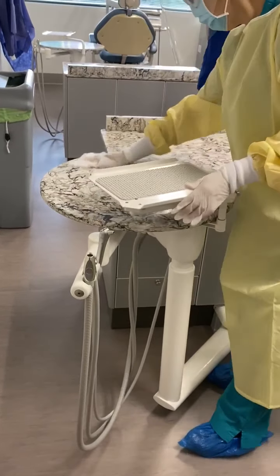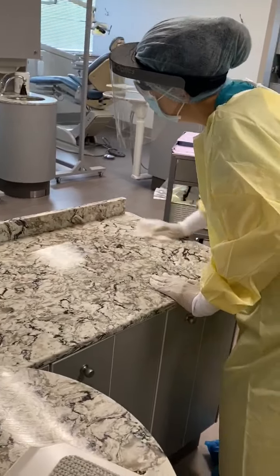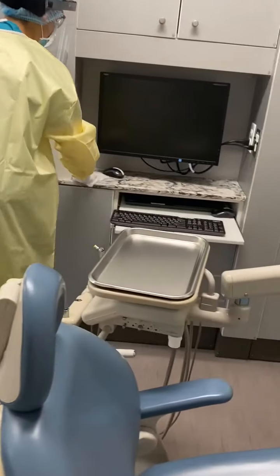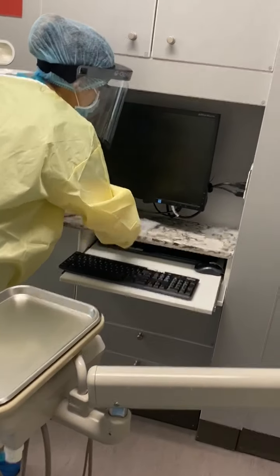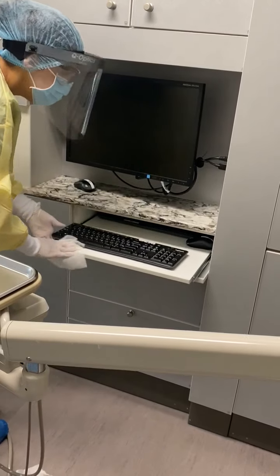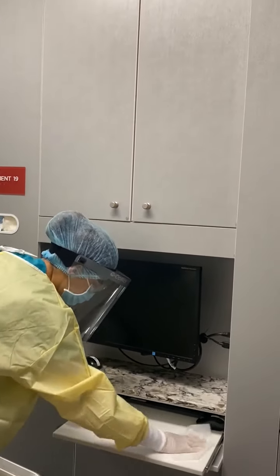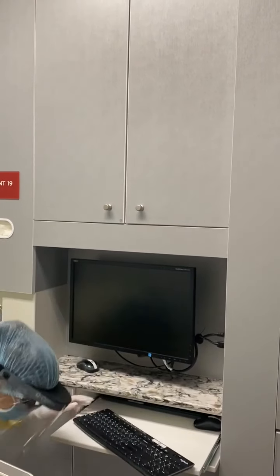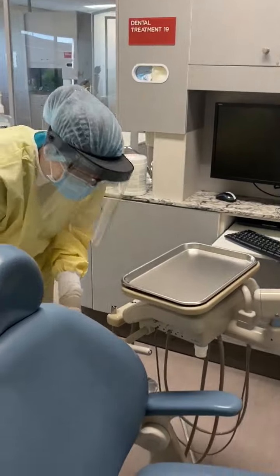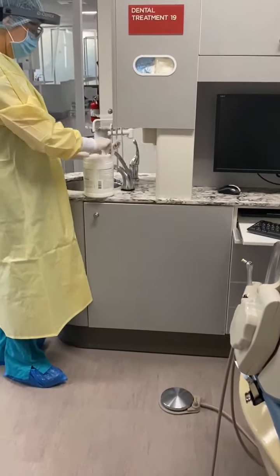All of the countertops, mouse and keyboard — moving the keyboard to get to the countertops there — as well as the cabinets and knobs. You may feel as though it gets dry at times, and if it does, you just grab a couple more wipes.